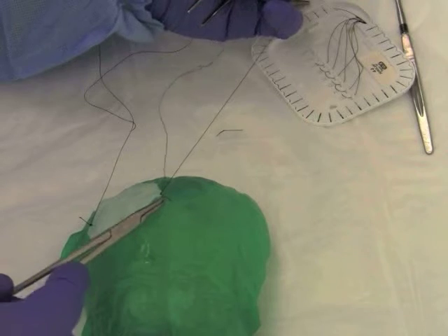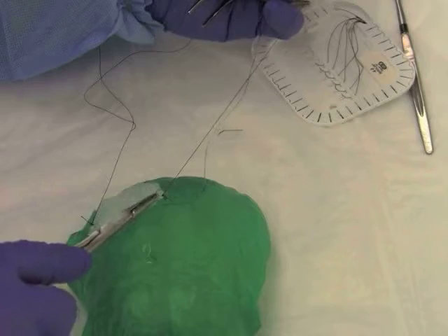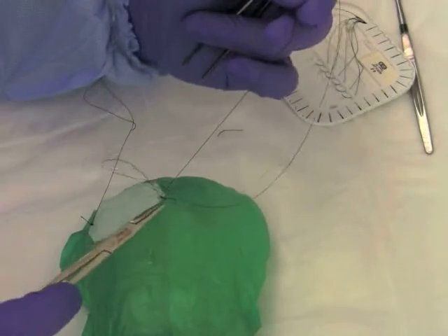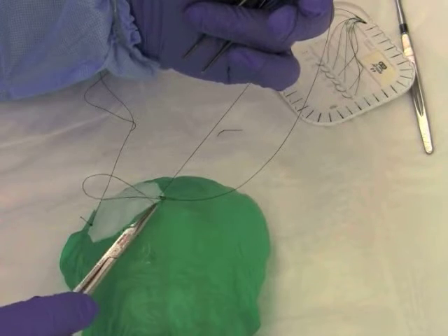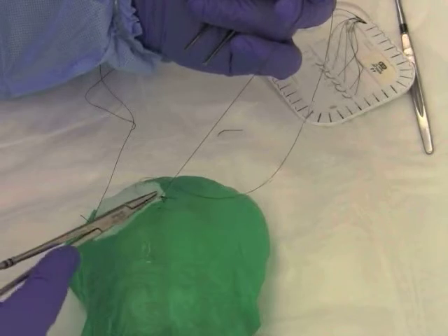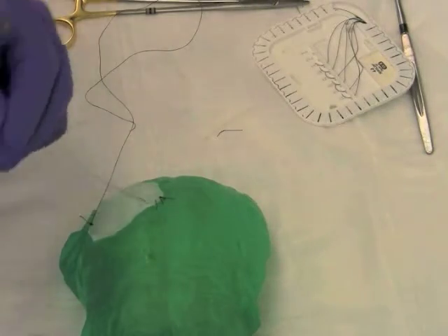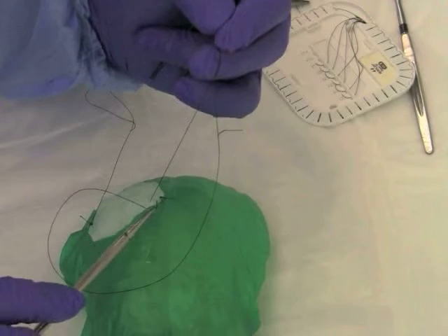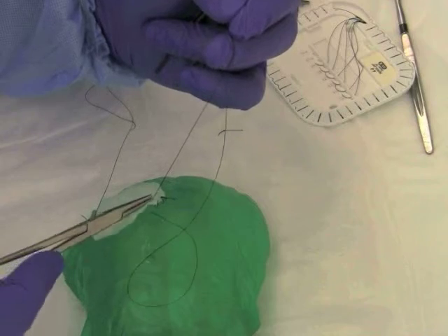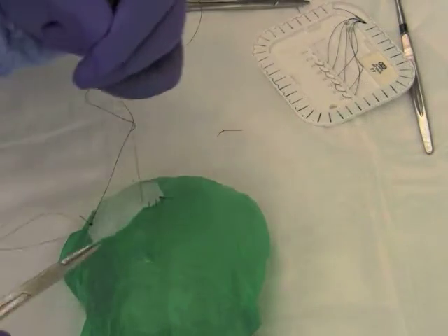In this case, a running suture is going to be used. Tension is maintained at the base and the stitch is carefully pulled through. As you can see with each stitch, tension is maintained at the base to keep the dural substitute well approximated. The stitches should be evenly spaced and care must be taken to not injure the cortical surface with the needle.